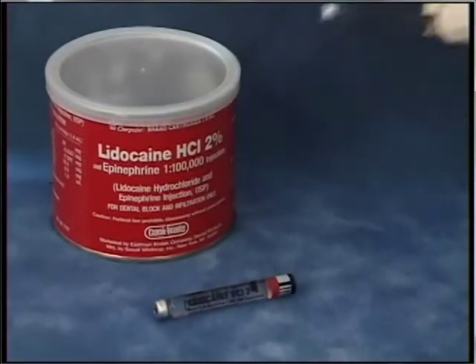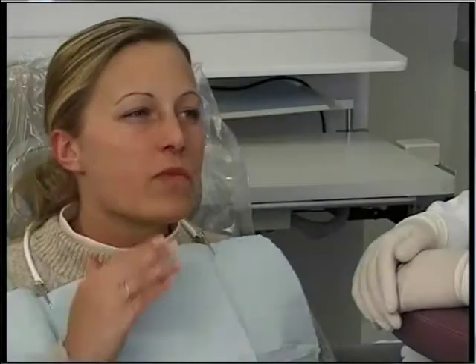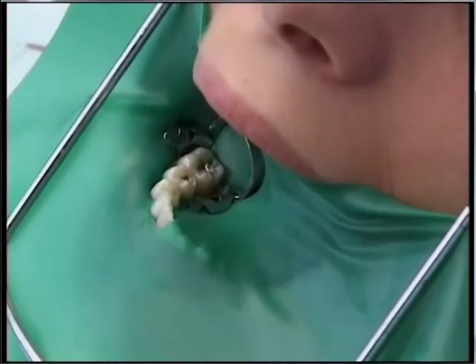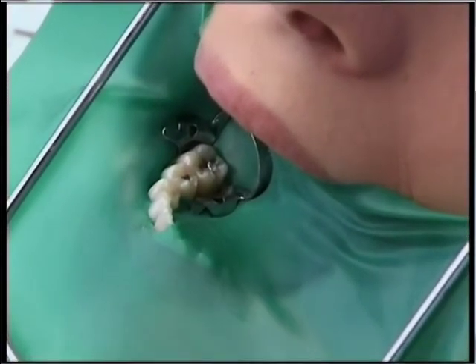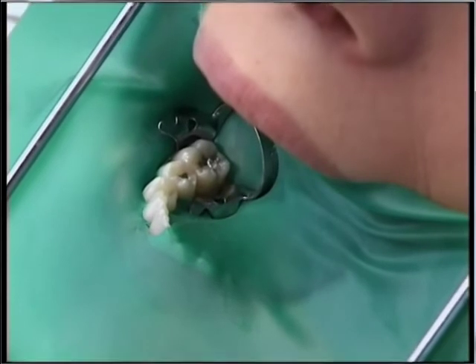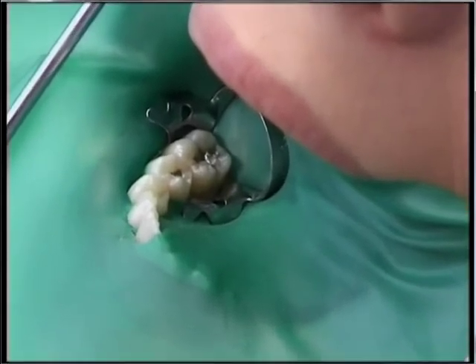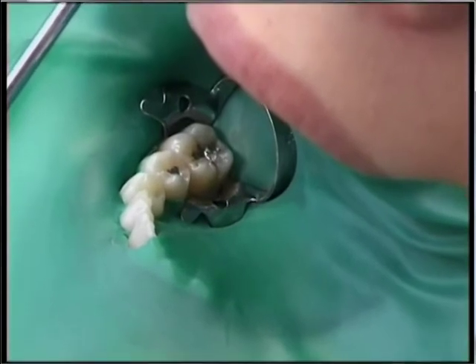We want the entire procedure to be comfortable for you, so the first thing we do is make sure you're thoroughly numb. We place a rubber dam around your tooth to isolate it from the rest of your mouth. It protects you like a safety net. Nothing can fall to the back of your throat. It also keeps the tooth dry and accessible so we can do a better job.